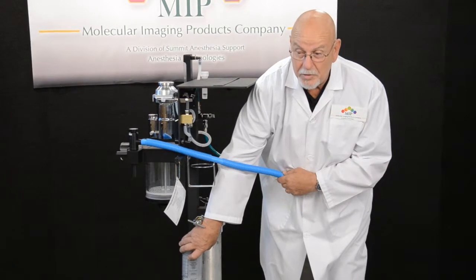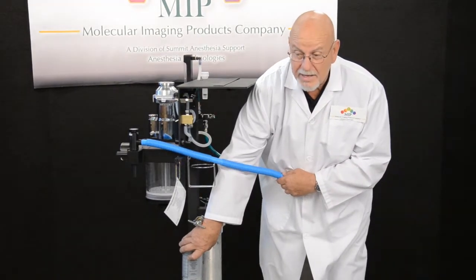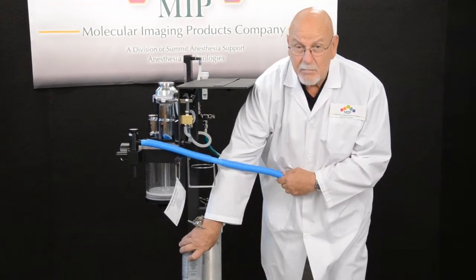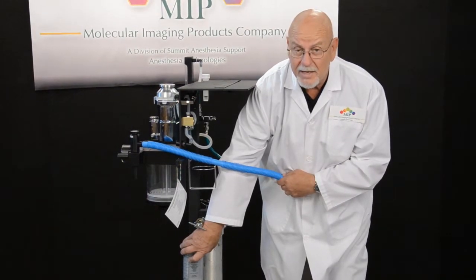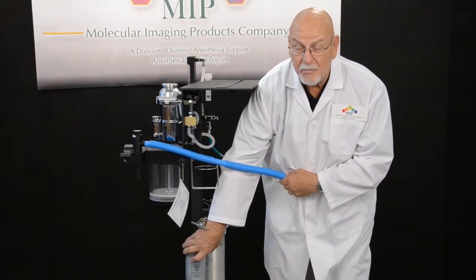These are to be weighed when you receive them, record that weight, and then periodically re-weigh them. When they have gained 50 grams of anesthetic, they're to be discarded and replaced.